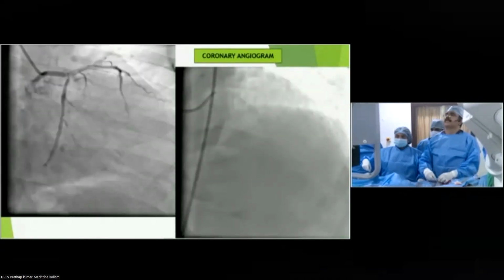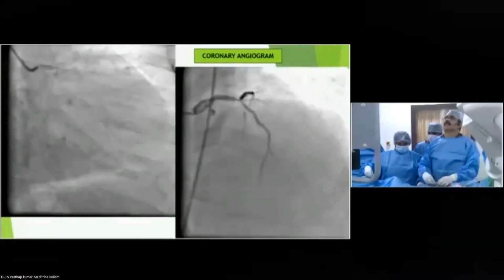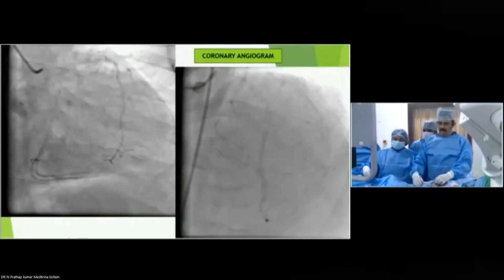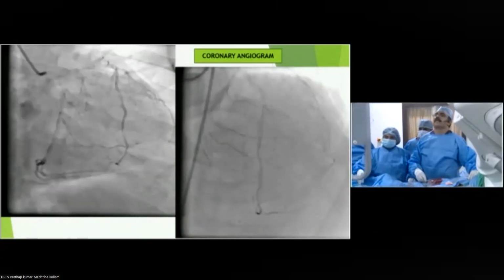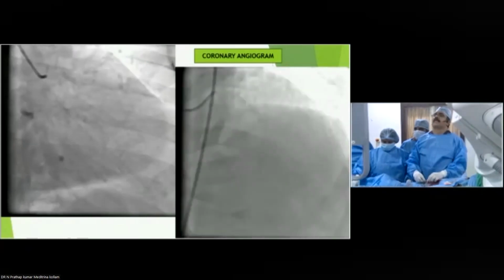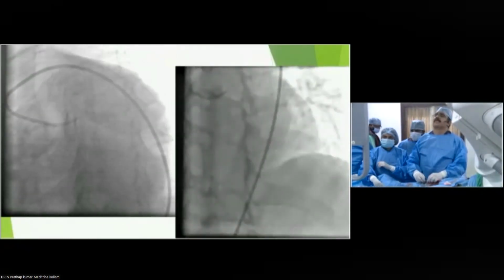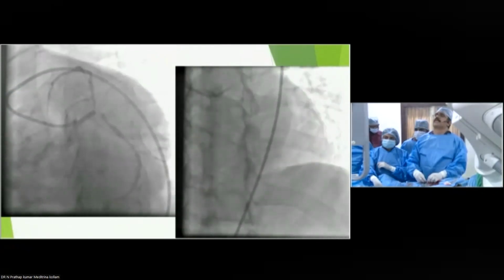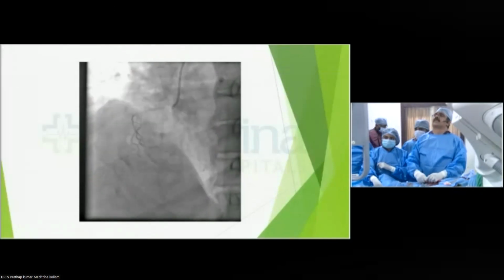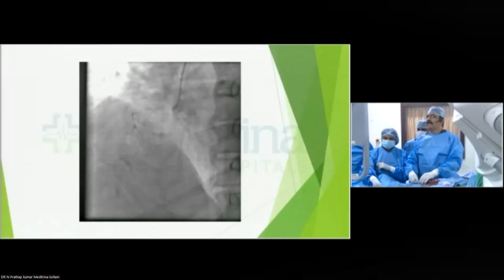The angiogram showed a significant distal LMCA disease along with tight ostial LCX disease. The ostial LCX had acute angulation, and there is a significant disease of the LAD stent also. You can see the acute angulation of the LCX, and there was calcium in the LCX ostium. RCA was non-dominant and diffusely diseased, and we are proceeding for LMCA bifurcation PCI.